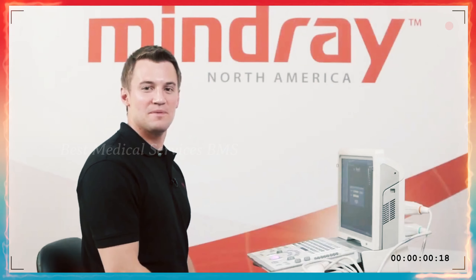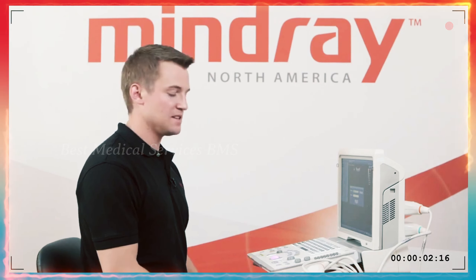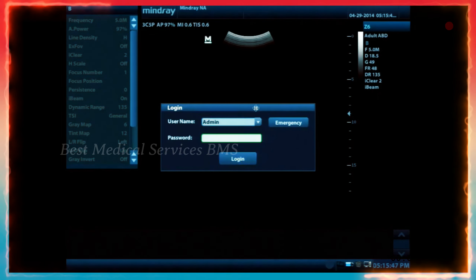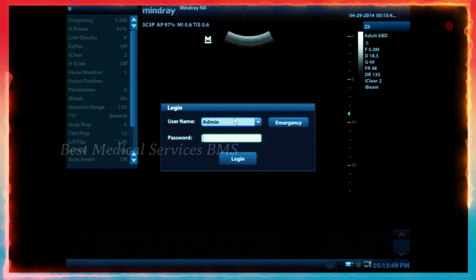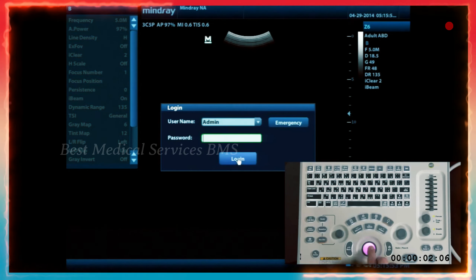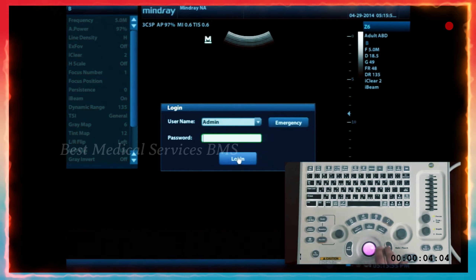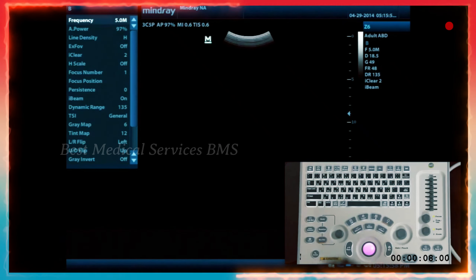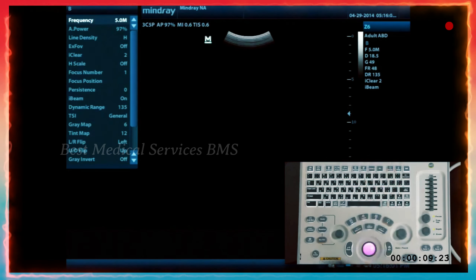Once your machine is booted up — taking about 25 to 30 seconds — the first thing you'll notice is a little login box. There is no password. Use the trackball to move the cursor and the set key to select login. From here, you're at the normal B-mode imaging screen.